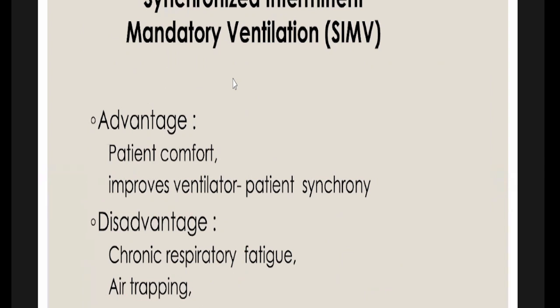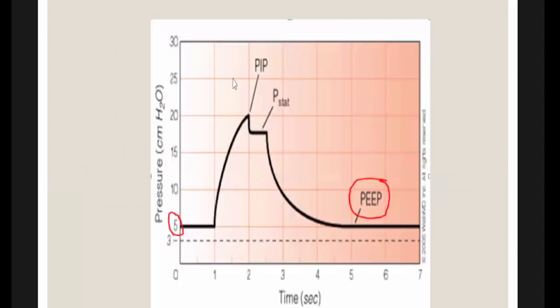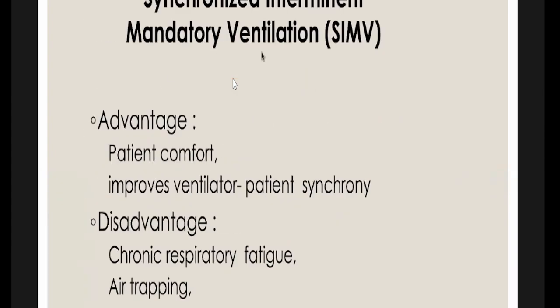And there are advantages of this mode of ventilation. So we have these synchronized intermittent mandatory ventilation modes. The advantages are patient comfort, and it also improves patient-ventilator synchrony, because the patient is very comfortable, because he is allowed to breathe.